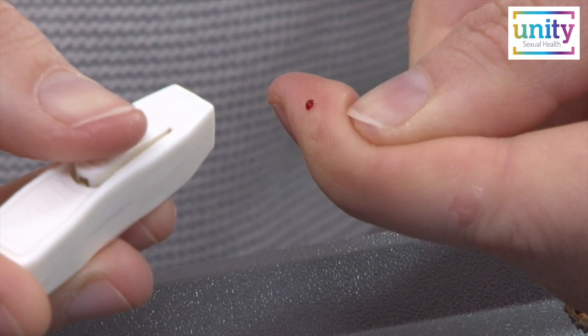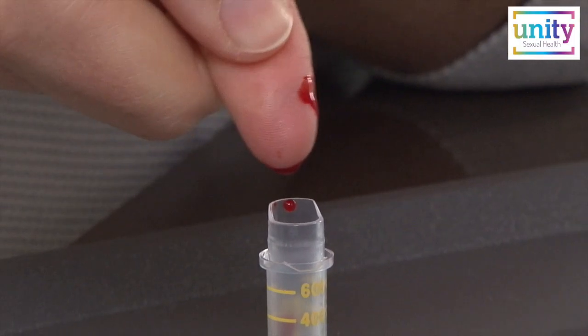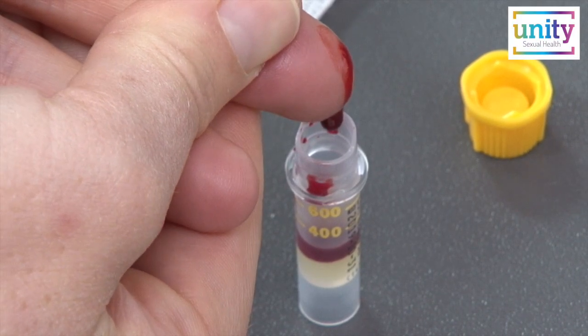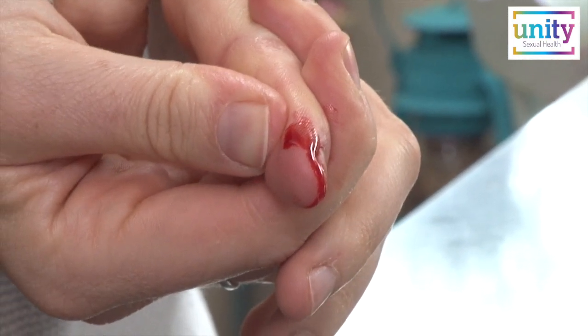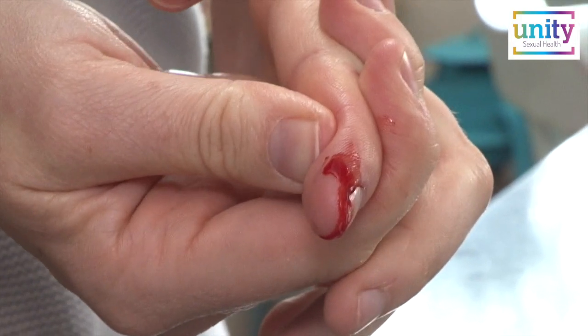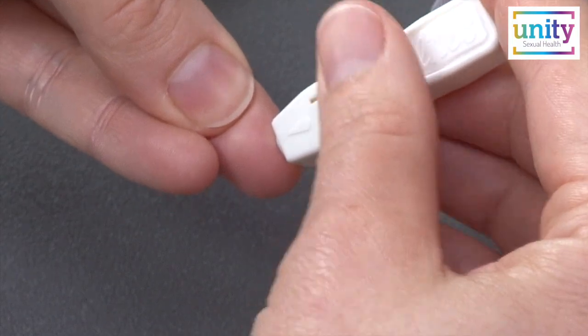Next, massage the finger until a droplet of blood forms. Hold your finger close above the specimen tube and continue to squeeze your finger to allow the blood to drip into the tube. You may find that the blood flow stops. If this happens and you have not yet reached the 600 point, you will need to choose a new finger. Some people may even need to do this with a third finger.